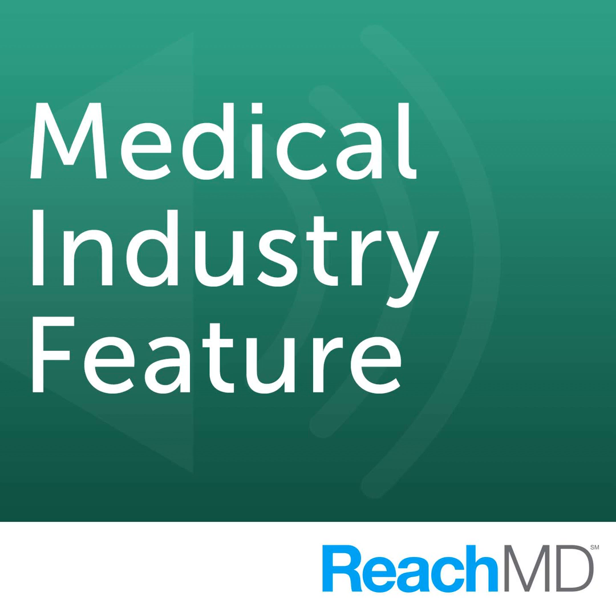Kidney biopsy is the gold standard for diagnosis of IgA nephropathy and C3 glomerulopathy in native or transplanted kidneys. Beyond diagnosis, kidney biopsy findings are also useful for predicting prognosis and guiding treatment decisions. A pathological diagnosis of IgA nephropathy or C3 glomerulopathy requires collection of an adequate tissue sample. This process typically involves a needle biopsy of the kidney collected under ultrasound or computed tomography guidance.